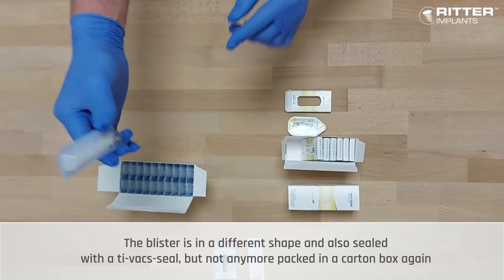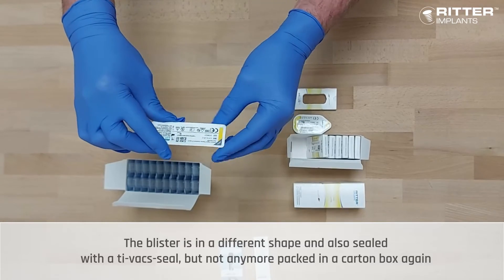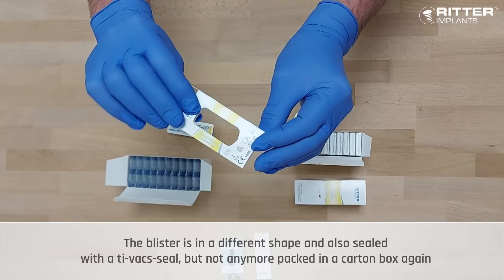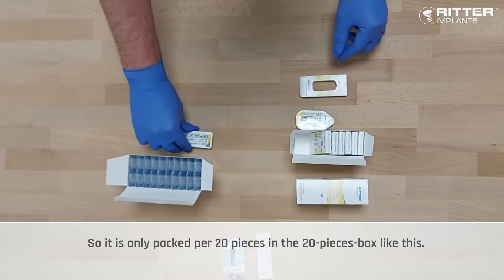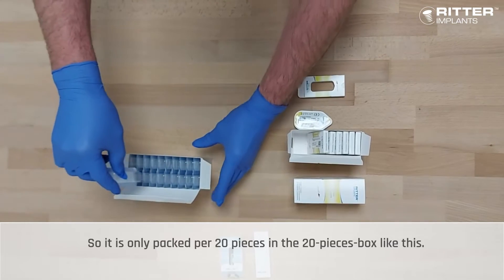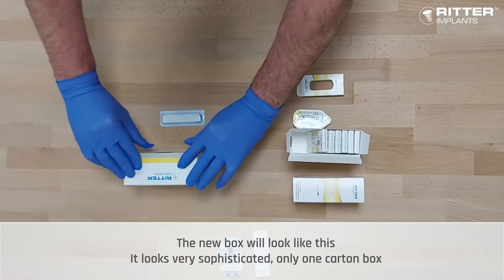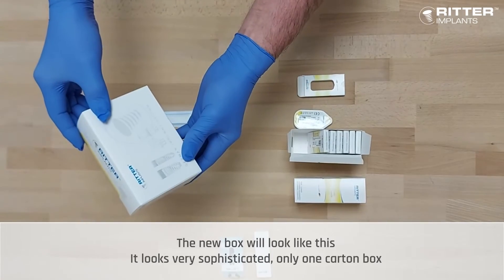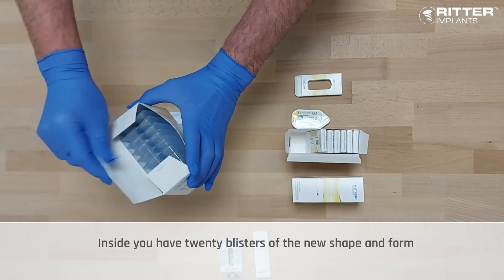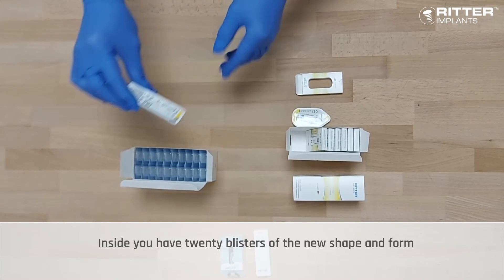The blister is in a different shape and also sealed with a Tyvek seal, but no longer packed in a carton box. It is only packed per 20 pieces in a 20-piece box like this. The new box looks very sophisticated — just one carton box with 20 blisters of the new shape and form inside.